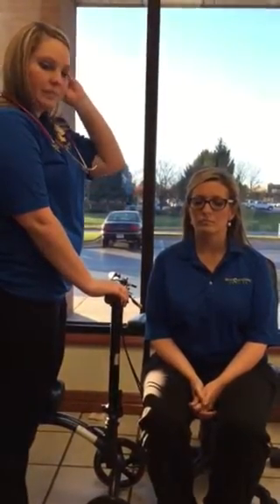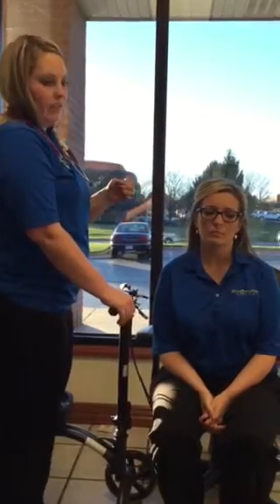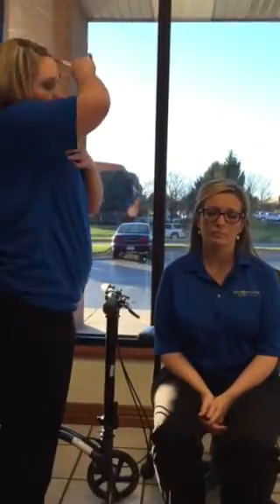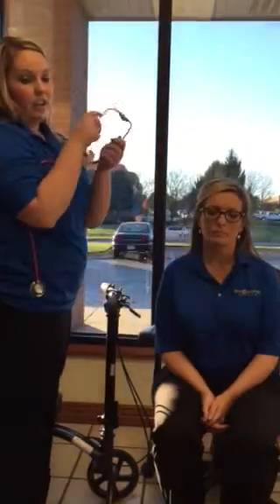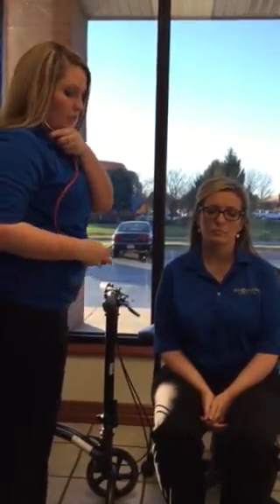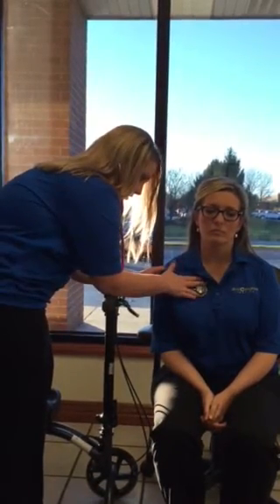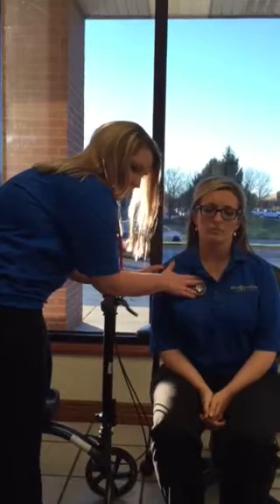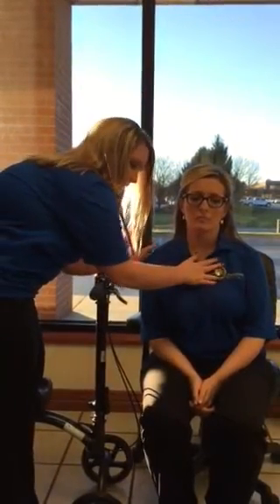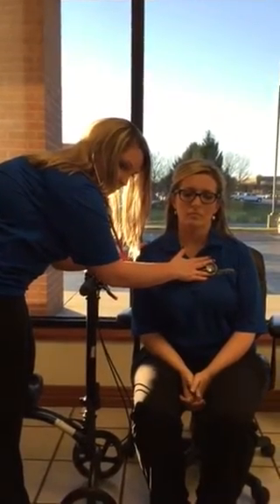So next, after the carotid artery, I'm going to listen to the heart sounds, and I'm going to listen at the 4 valves. The first valve that I'm going to listen to is the aortic valve, and it's located in the second intercostal space on the right sternal border. The next one is the pulmonic, and it's in the second intercostal space on the left sternal border.